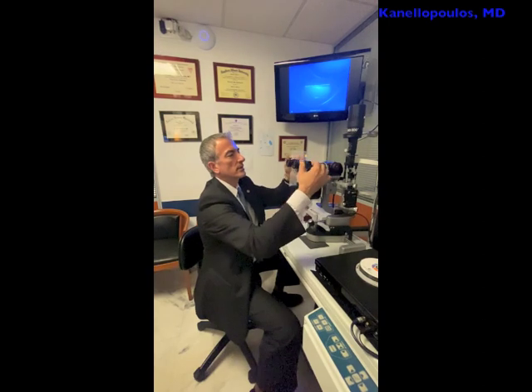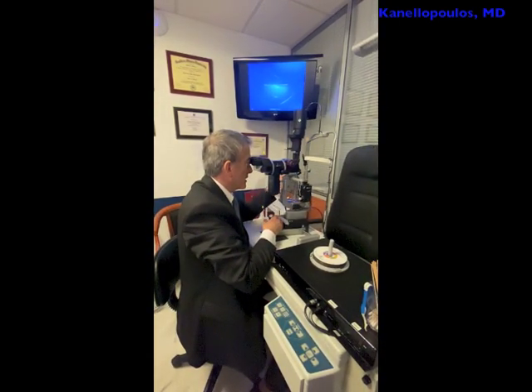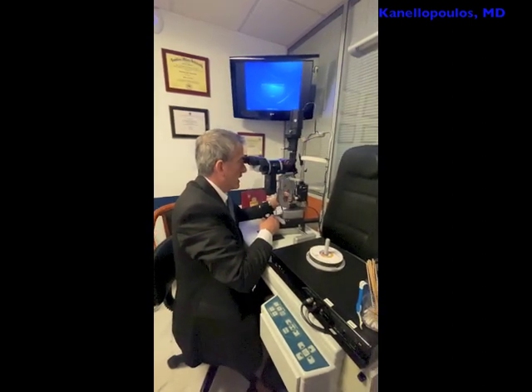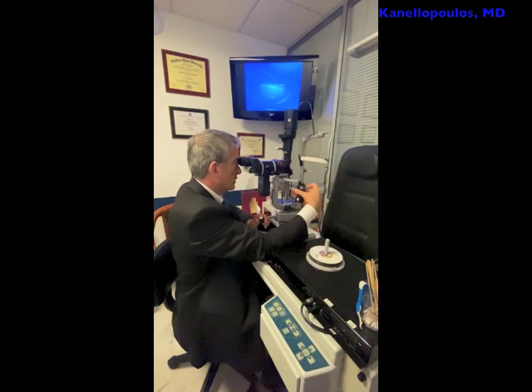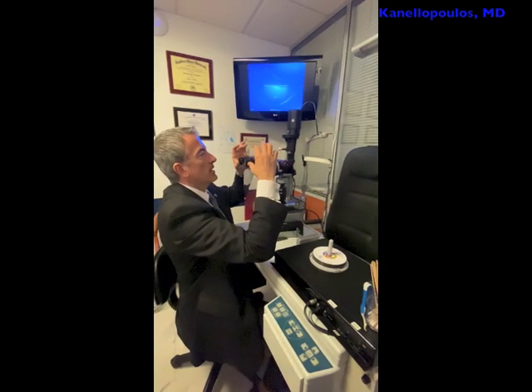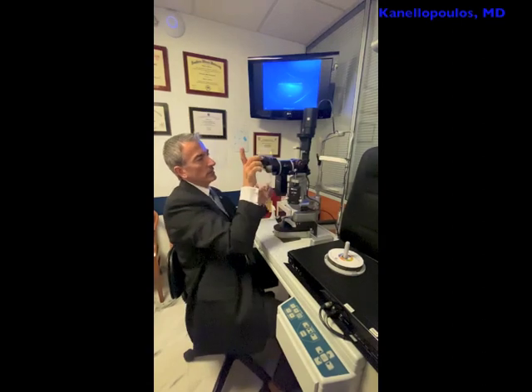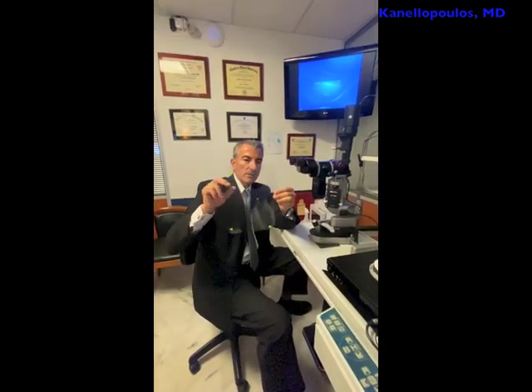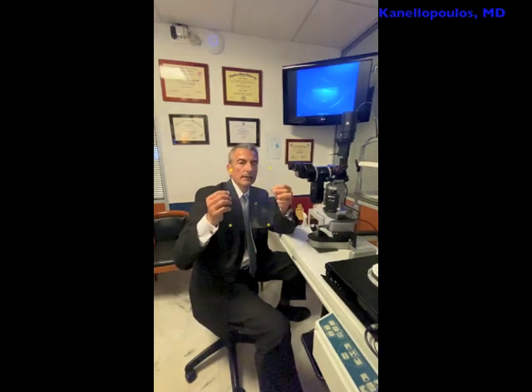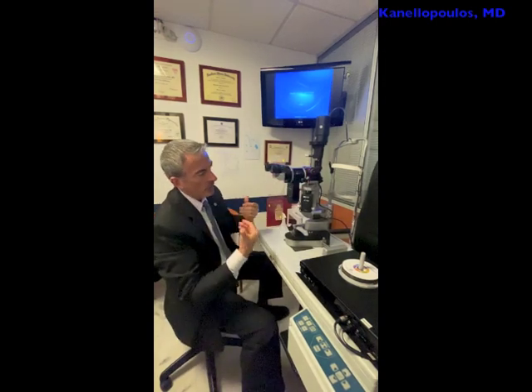My PD is quite large, so I'm going to adjust it — I'm at maximal PD. And this way I can come in and examine. This does not hinder at all the management of the slit lamp. You can see how easily my hands move around it, nor will it make difficult the IOP measurement or the adjustment of the Goldmann applanator, as you can see here. It creates a very good shield. We went with a commercially available model, created a larger shield on top, and made it a little bit longer than usual. We took the standard opening present in some of the more rigid plexiglass or acrylic structures that go over slit lamps, made it longer, and these are the specs we'll share with you. It takes a few minutes to make and creates a nice shield between the examiner and the examinee and vice versa.